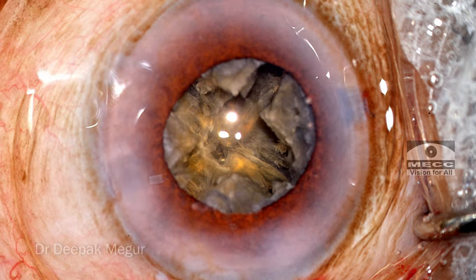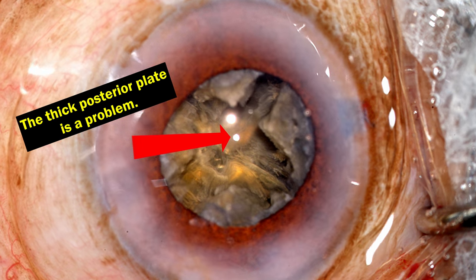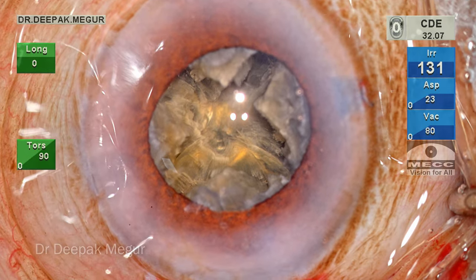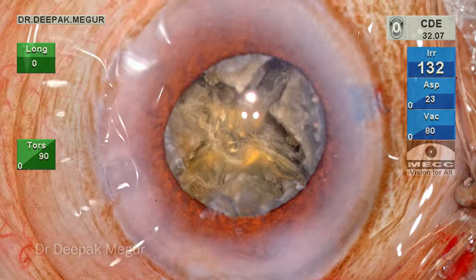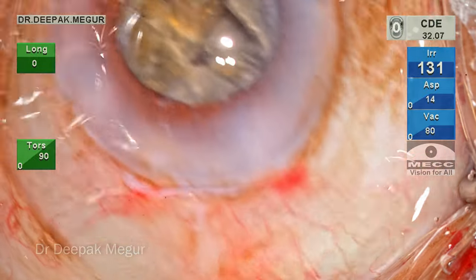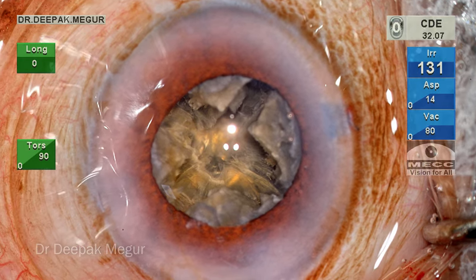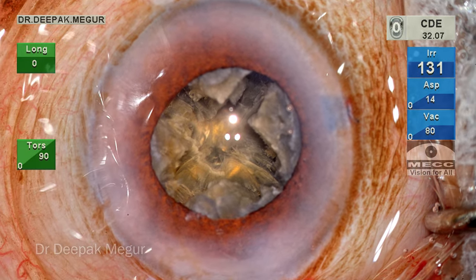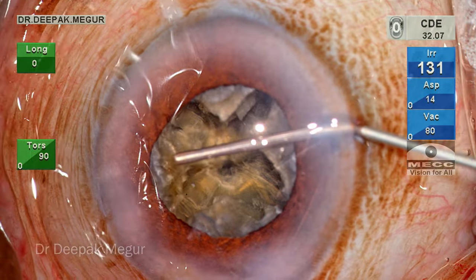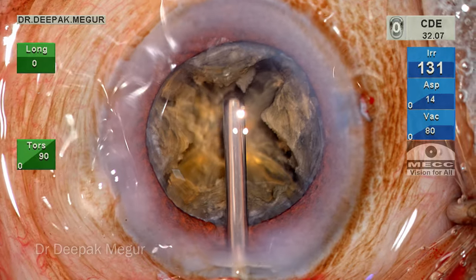It is important to realize that we don't have to panic and do anything silly. Once I realize what the problem is — that is the central attachment — it's going to be very difficult to break now, so we need to find a way to circumvent it. The first thing I do is try to bring one fragment out of the bag and then forcefully do the separation of its root from the central point. Once we have enough space in the bag, managing the remaining three pieces is going to be relatively easy. The cornea is again coated with OVD and the BSS connected to the phaco machine also has adrenaline added to maintain mydriasis.